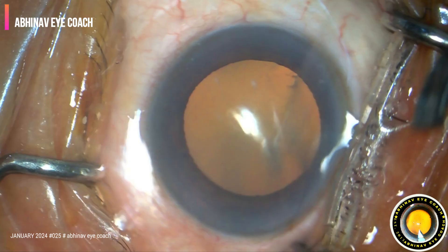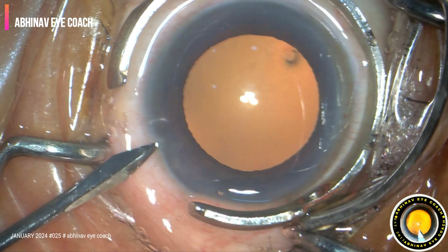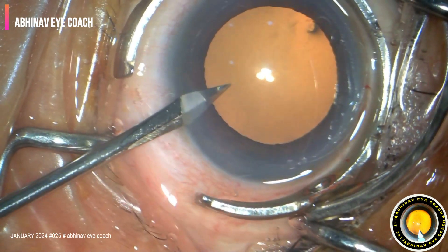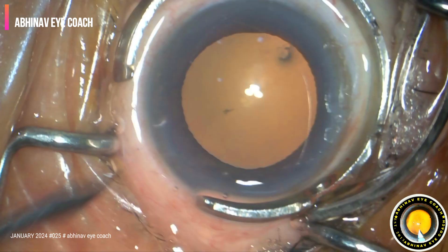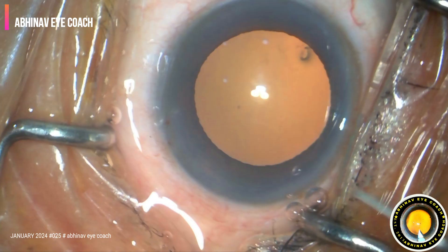Just to start with the surgery, mucus strand in the eye washed with the BSS balanced salt solution. Two side ports were made. Eye stabilized with the scope's globe stabilizer.